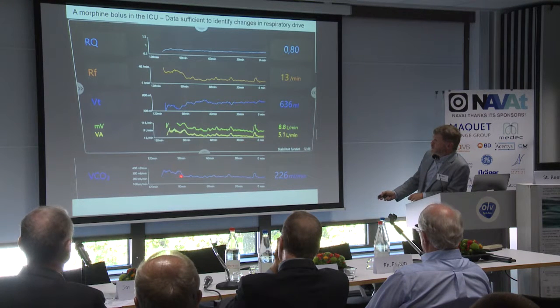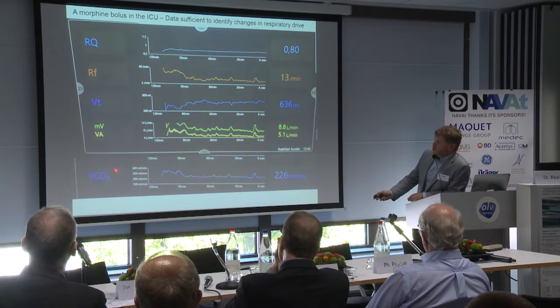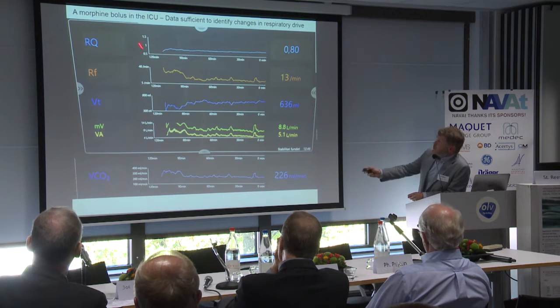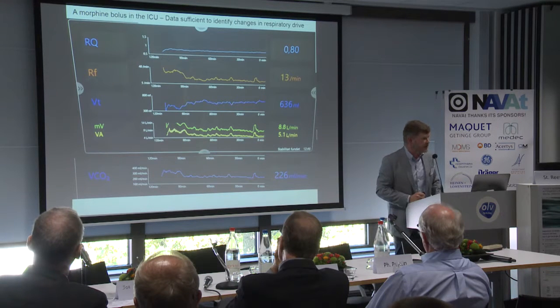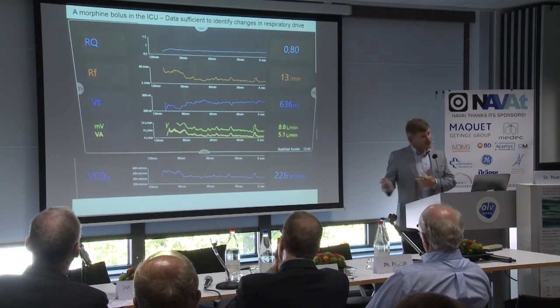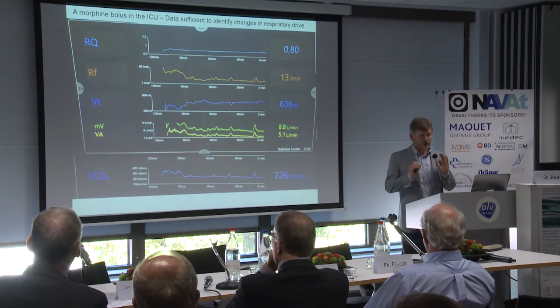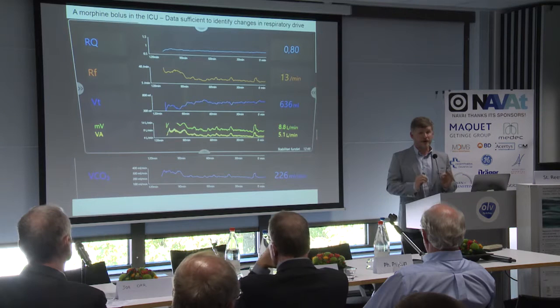You can see it's almost a step function. And not only did it do it for the CO2, it also did it for the oxygen. You can't see that here, but you can see the respiratory quotient was constant. So the oxygen signal said the same. And this data, and I wish I had the results to show you, but this data is sufficient to estimate parameters describing respiratory drive. These step changes are sufficient to monitor progression of respiratory drive as the patient is waking up.